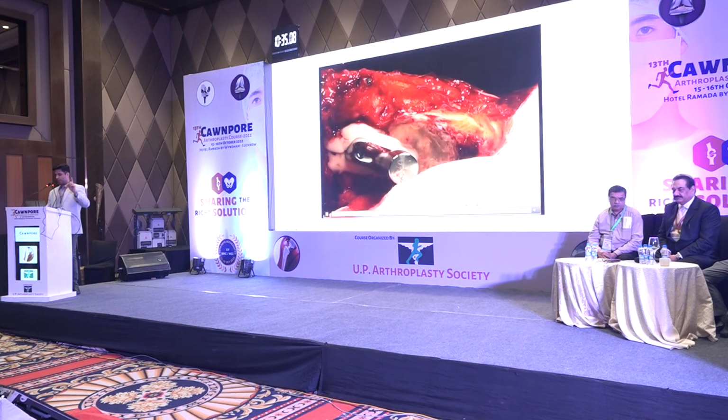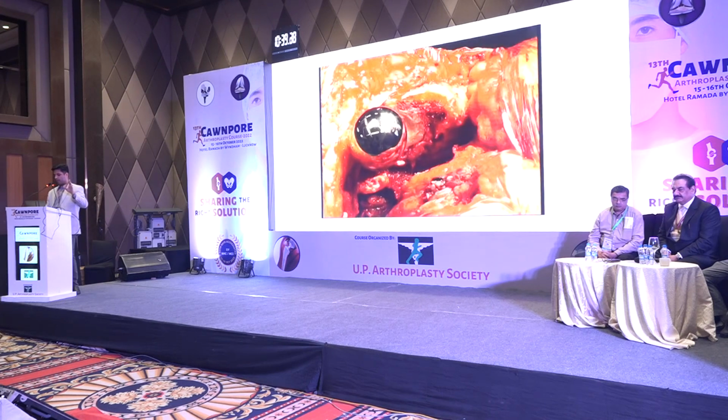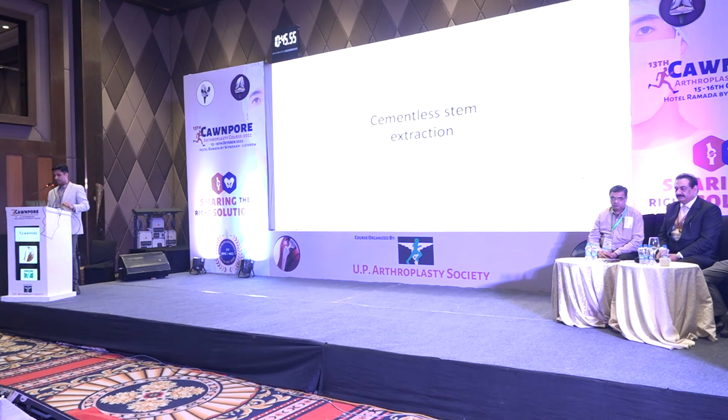And once you've packed that, you can see the junction between the new cement and the old cement, and then you can do the reduction and you can get away with a smaller size implant, as I showed you in that. That's your cement in cement femur.